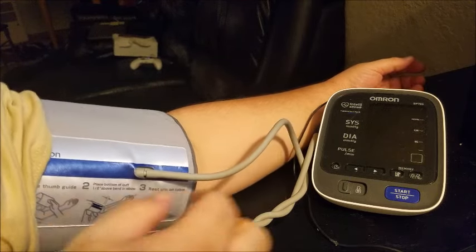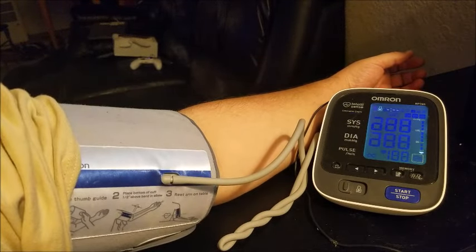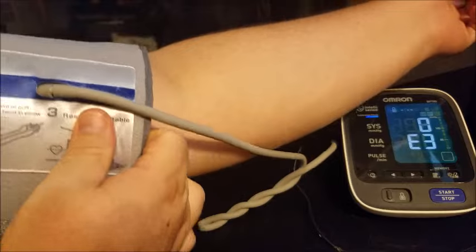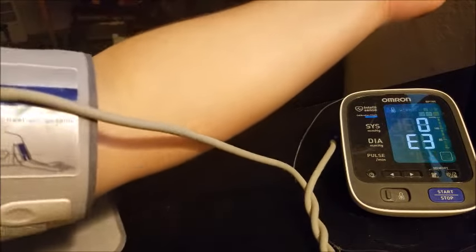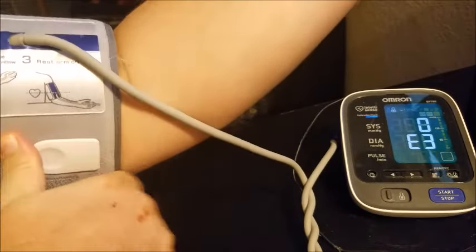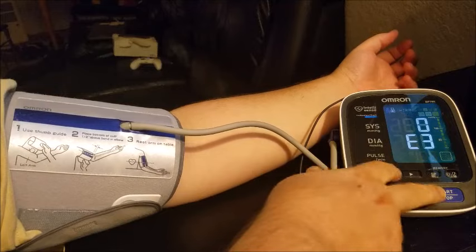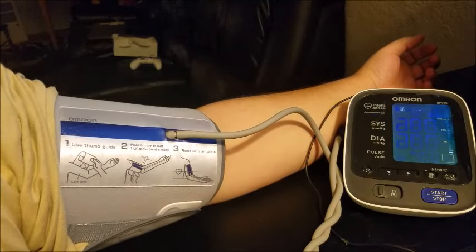Let's go ahead and check my blood pressure now. That's an E3. I feel like I got my cuff on tight enough — see where the line is going where it's supposed to be? A lot of these machines are finicky, the newer ones. They're not really made as well as the older ones, it seems like. And if you look at the reviews on Amazon, they're a little bit worse than the older ones.